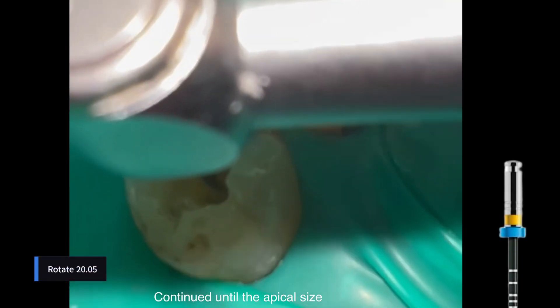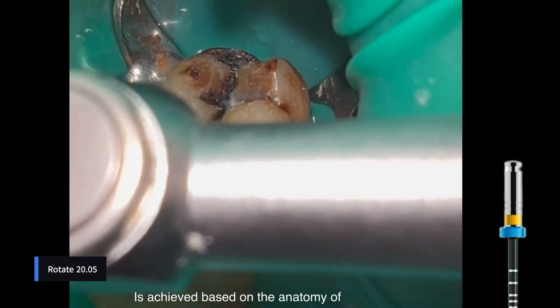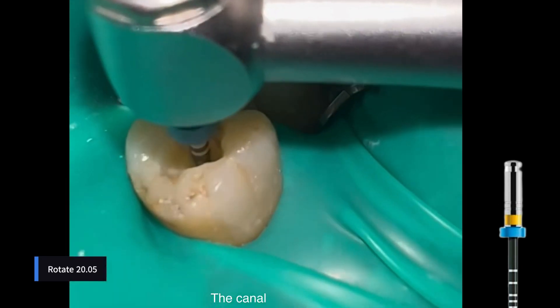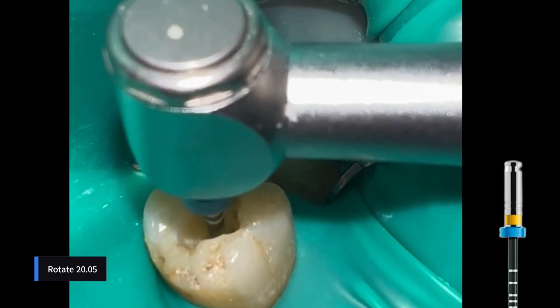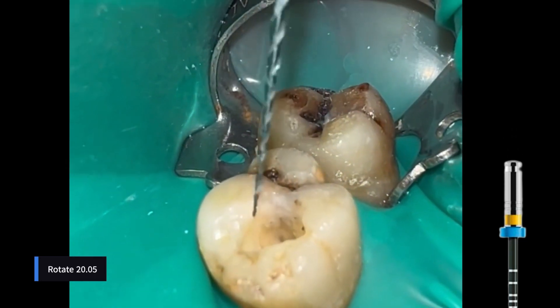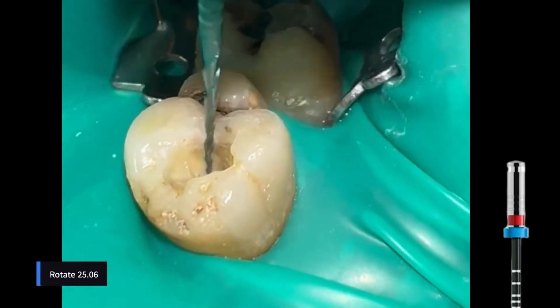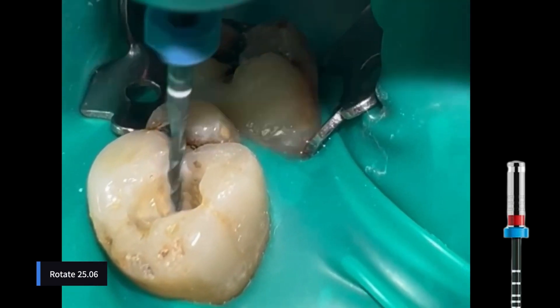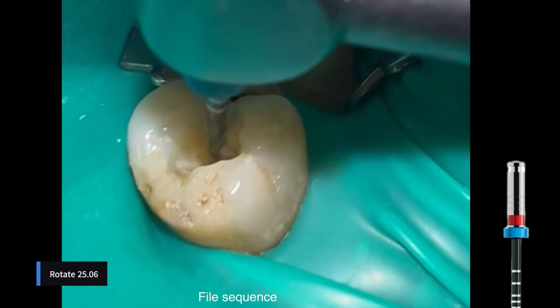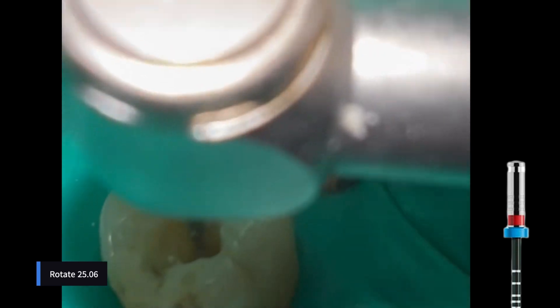Instrumentation is continued until the appropriate apical size is achieved based on the anatomy of the canal. After completing the file sequence, apical gauging must be performed.